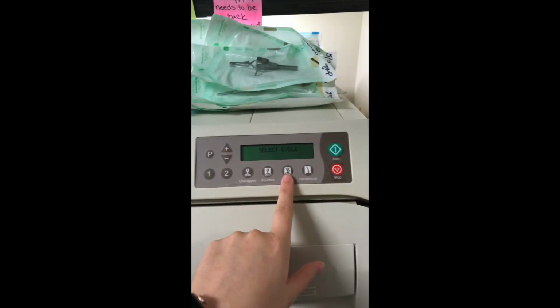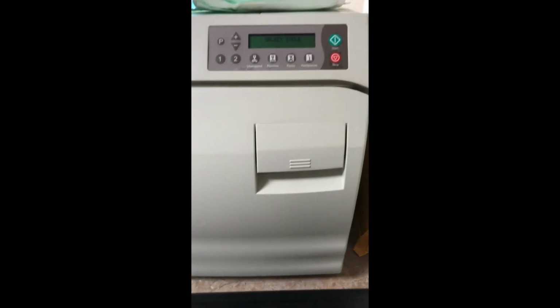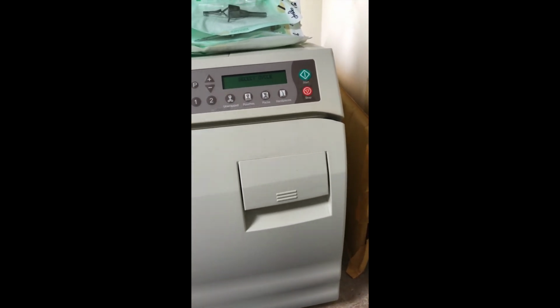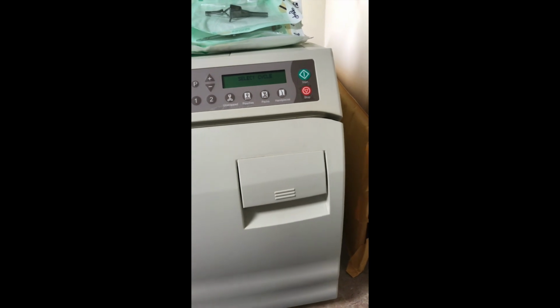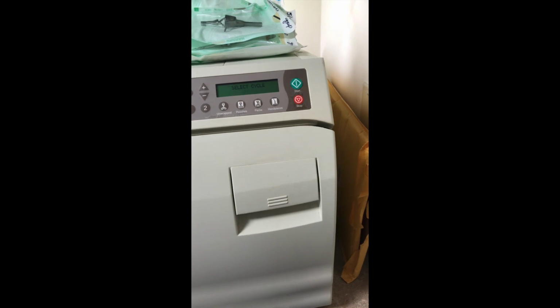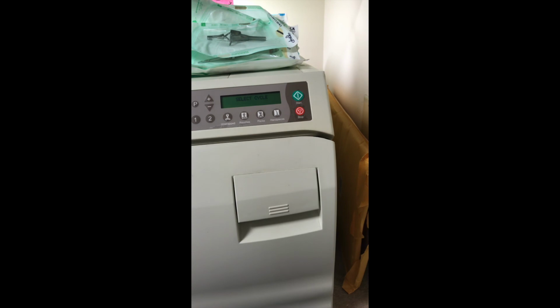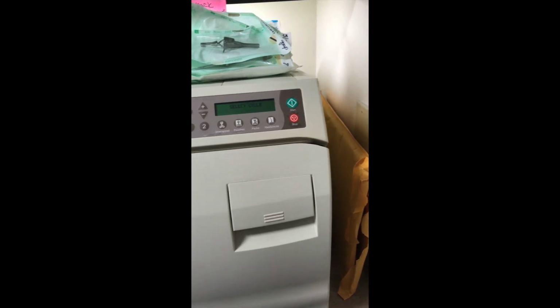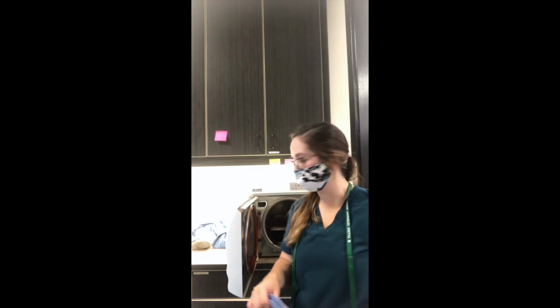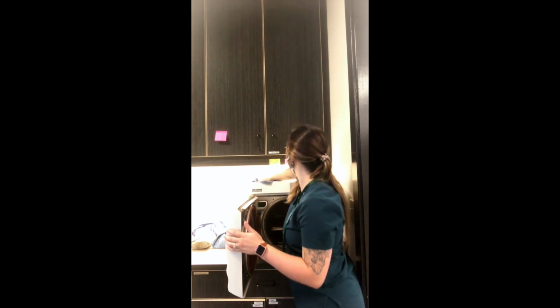These are packs, so we would literally just press pack and start, and that has its own settings for temperature and time. Usually it takes about 45 minutes for them to be sterilized and then the steam to evaporate. The temperature will probably get between 250 and 270 degrees Fahrenheit, and your pressure needs to be between 15 and 27 psi.